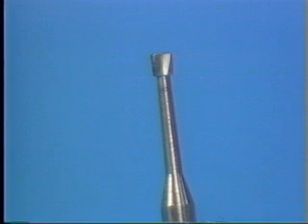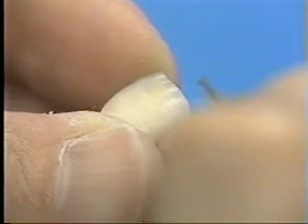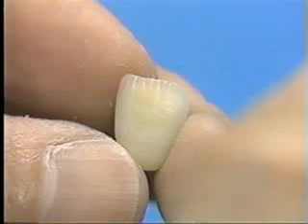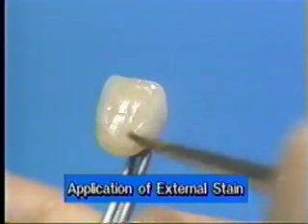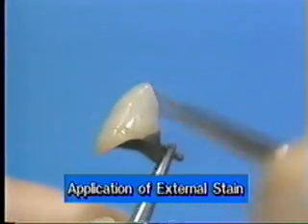Use the carbide burr inverted cone to grind smooth the enamel crack line with a slight touch. Clean with ultrasonic wave, and if necessary, go to the external staining.